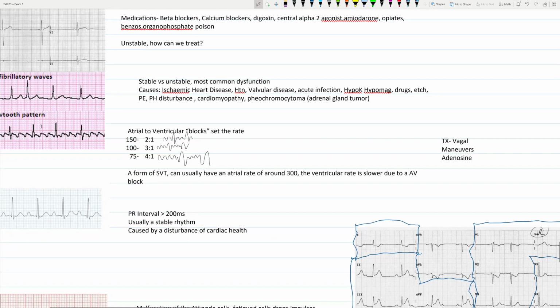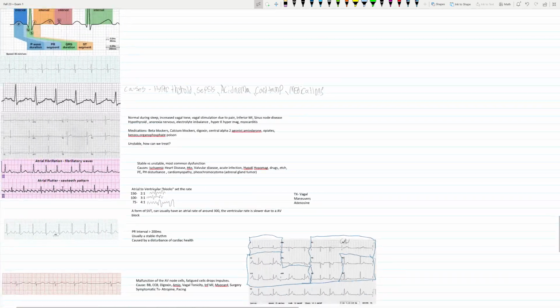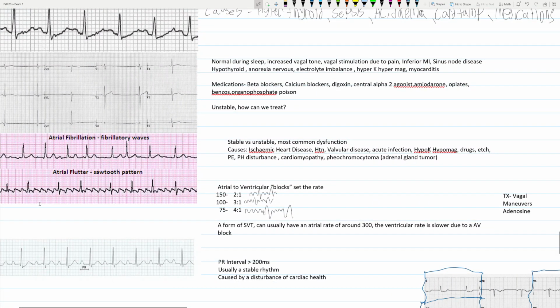And we can see if we look in our EKG here, or a little strip. If we're looking over here, we can see we have 1, 2, 3, 4, 1. And then we have 1, 1, 2, 1, 1, 2, 3, 4, 1, 1, 2. I call that 3-to-1, 2-to-1, 2-to-1, maybe 3. So we can see we can have variation, but it could also be at a set rate of just 3-to-1 the entire time. So there is the possibility for variation, or it can be regular.